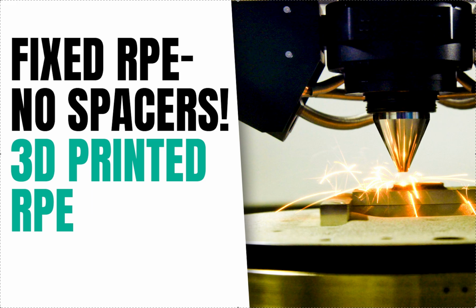It only goes around the gingival contour, so it's not a huge issue with caries or anything like that. It's very minimal, the amount of bonding that's needed. And because it's 3D printed, unlike a band which isn't custom, there's no space. It's custom, so there shouldn't be any space. It's like an inlay or onlay. It's made for that patient, so everything should just go on perfectly. You shouldn't have fit issues. Just a little etch and bond, and it should go straight on.